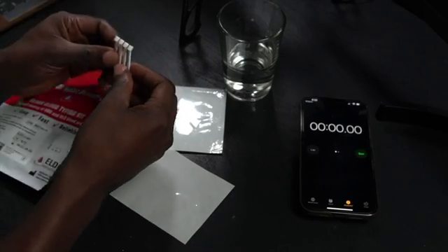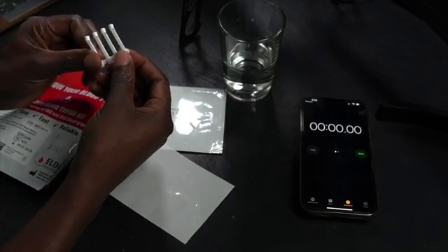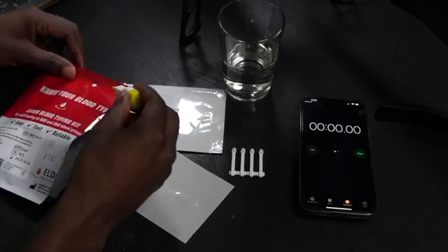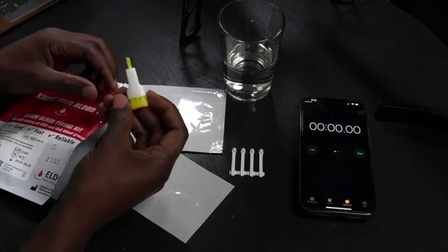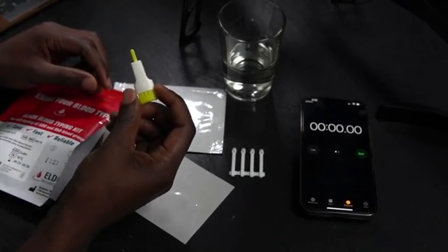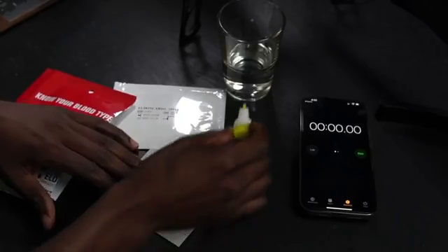Here we have the Eldon Sticks. We have four of these, and you'll see how we use this pretty soon. And next we have this, the lancet. This is what we're gonna use to puncture our skin and get the blood. Now don't worry, it's not gonna hurt that much.